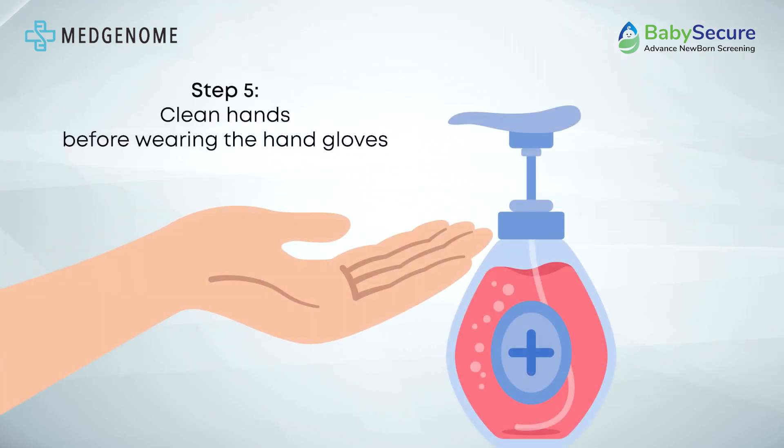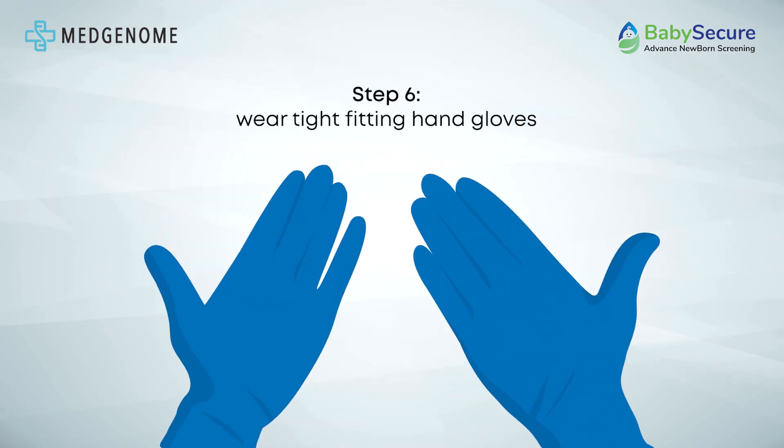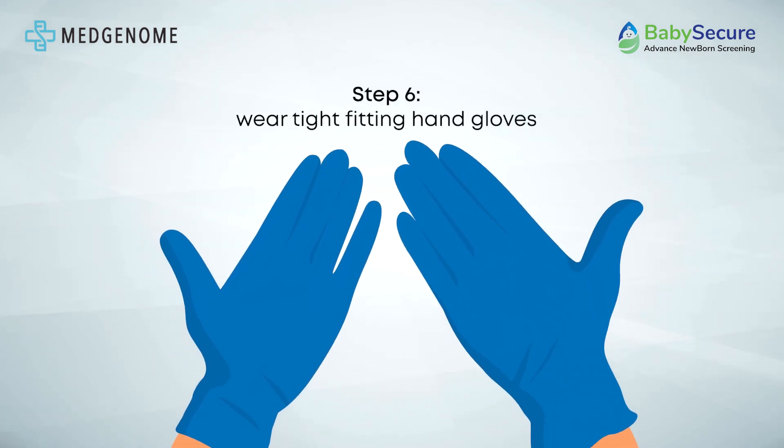Before initiating blood sample collection, thoroughly wash hands with soap, rinse well, and dry. Then ensure proper glove fitment for hygienic handling.